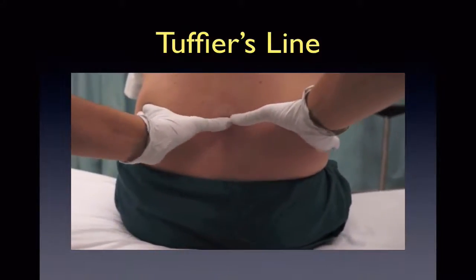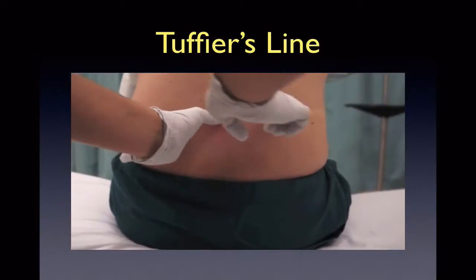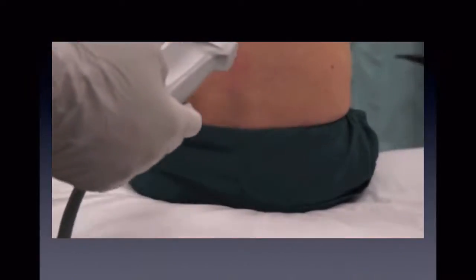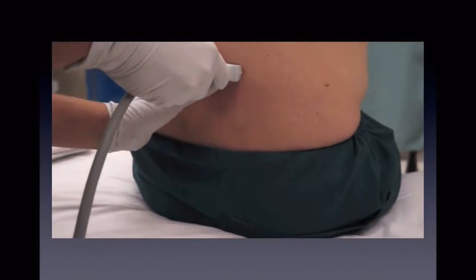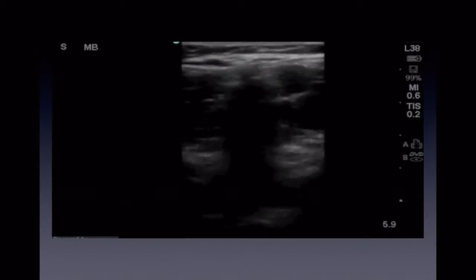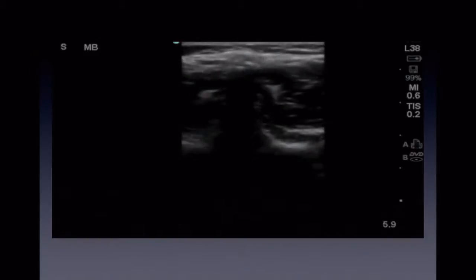Here we can see how one can identify Tuffier's line by palpating the posterior superior iliac crest and drawing an imaginary line across the back. This ensures that we are below the level of the spinal cord. Now you can place the ultrasound probe midline in the transverse plane over the spinous process along Tuffier's line. Visualize the dome-like hyperechoic line of the spinous process with posterior shadowing in the middle of your screen.